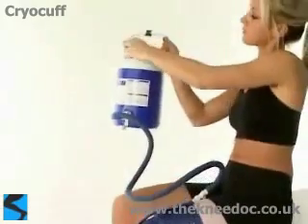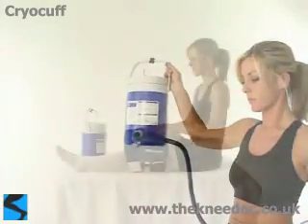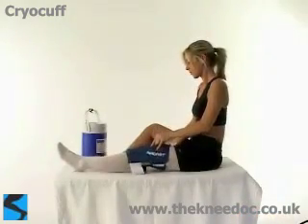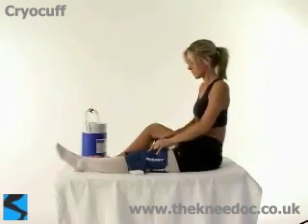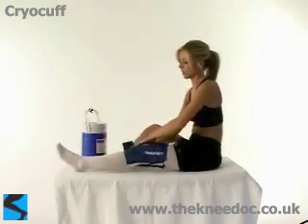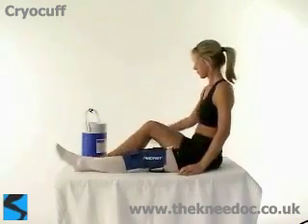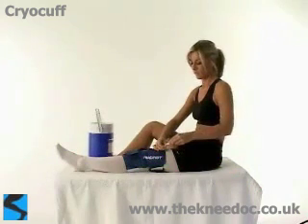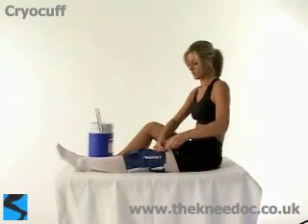The quicker the swelling can be reduced, the quicker the rehabilitation process will progress, both after an injury as well as when recovering from knee surgery. The important thing when putting the Cryocuff on is to make sure that the sleeve which goes around the knee is empty. Never try and put the Cryocuff on when it is full of water.